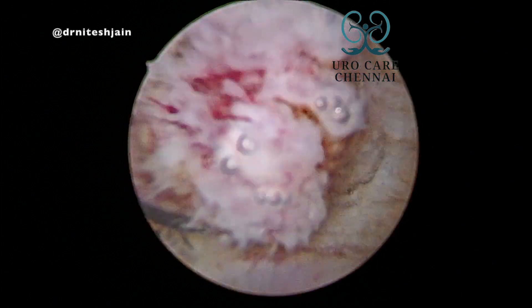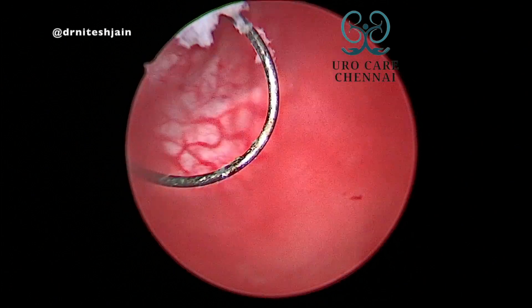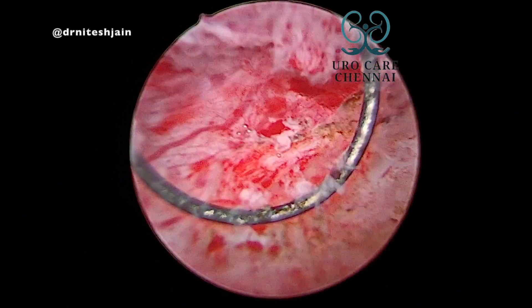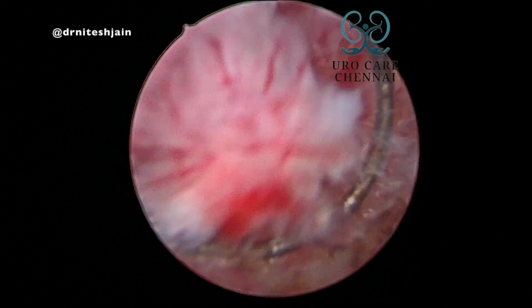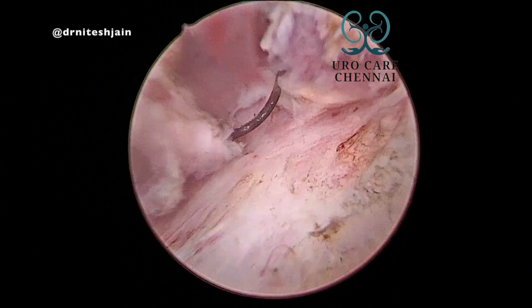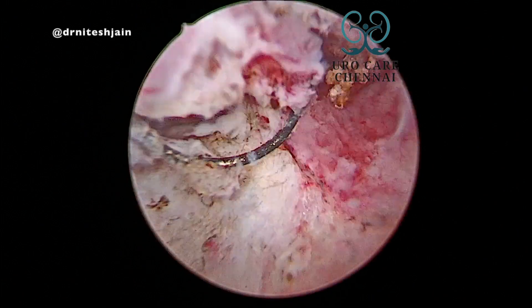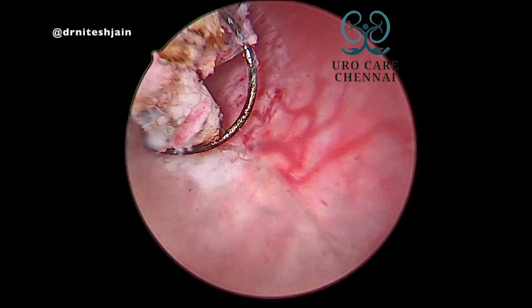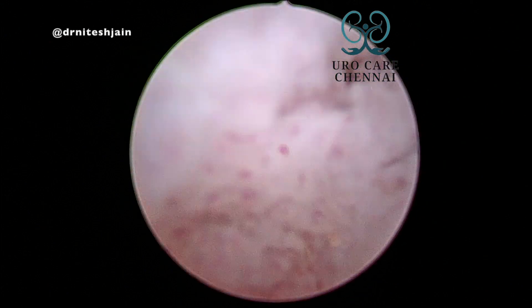Whereas if you cut from the top — it is like a tree with branches — you will have to face many vessels, and coagulation in that area is also difficult. So use cutting current and don't try to coagulate too much when you are not seeing the VUJ.